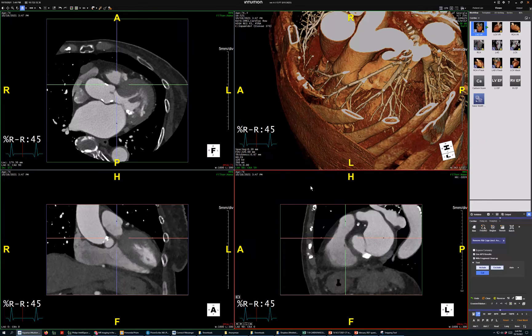Hi, this is Mike Winkler, Medical College of Georgia. One of our residents, Kevin, is with me and we're going to do a five-minute TAVR.